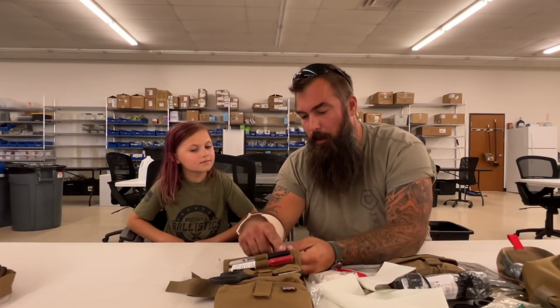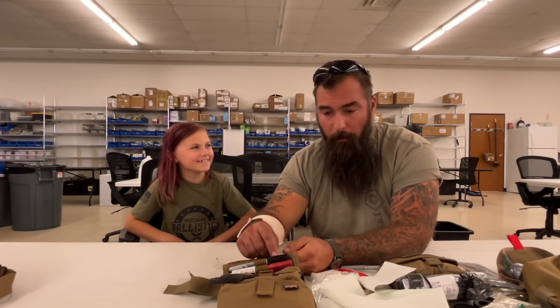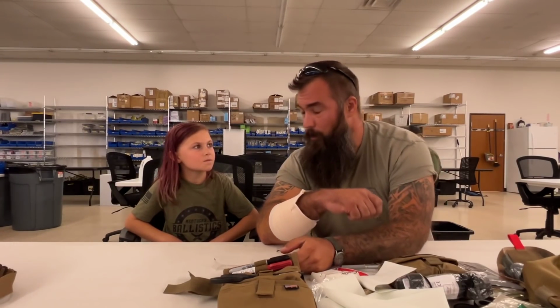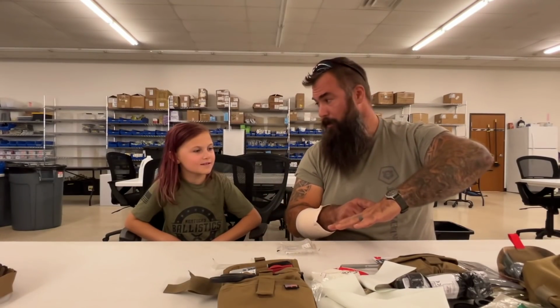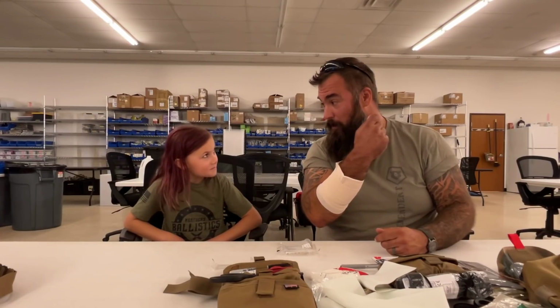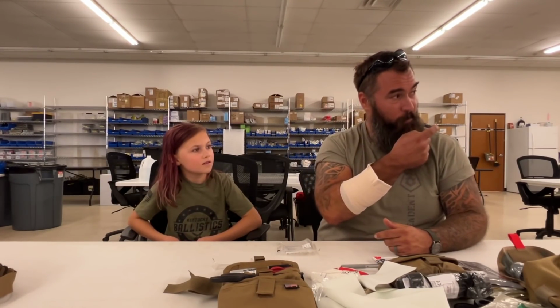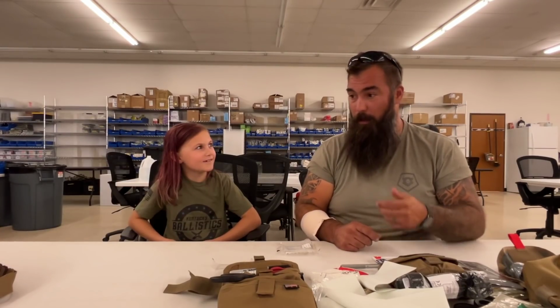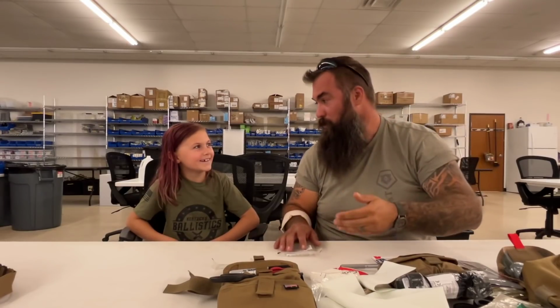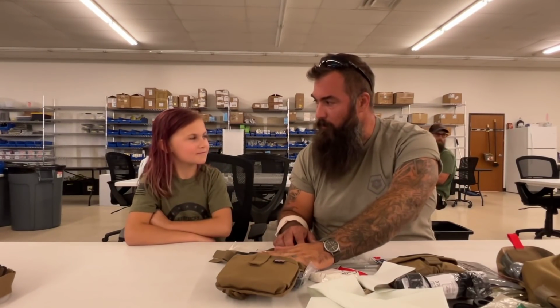This is a Sharpie so that you can draw unicorns and stars on me while I'm screaming. It's also for writing the time that a tourniquet was applied. And usually you can write that on the person's hand or on the tourniquet, or oftentimes they'll write it on the person's forehead. So that way you can't miss it when the ambulance shows up and there's numbers on the person's forehead, like, hey, what time did this tourniquet go on? That's when it went on. So that's why the Sharpie's in there. We talked about the shears for arts and crafts and stuff, right?